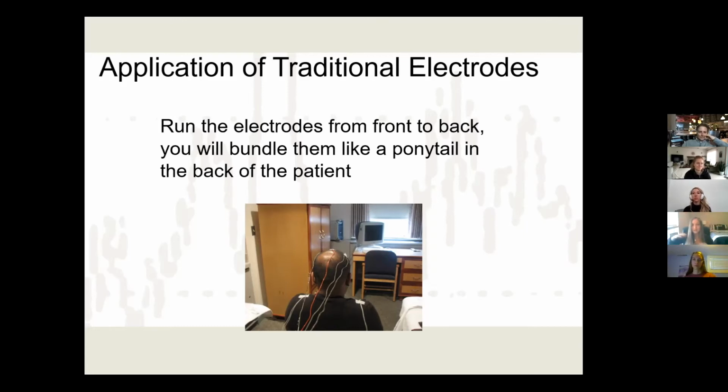So for girls or guys, if they have long hair, I will always make them have a middle part, which some people hate, but I'm sorry. And that just helps you, so you're not trying to put electrodes and then there are parts over here, and visualizing that is super weird. So part the hair however you need to, grab the hair, pin it up. We have little hairdresser clips, and that can help you when you're cleaning the site, you can pin the hair side to side.